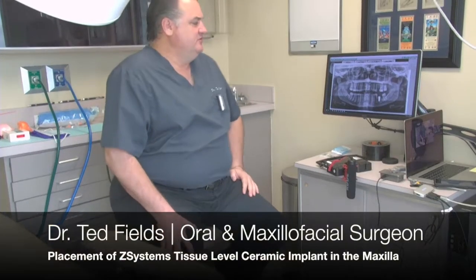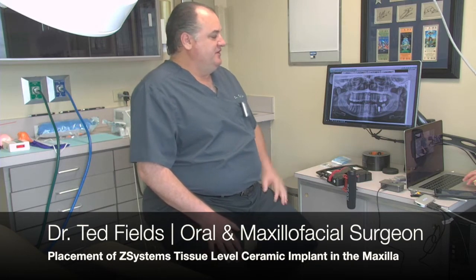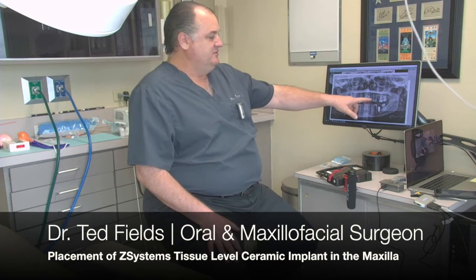Today we're doing a simple upper second premolar implant. We're using Z Systems Z5C implant, a two-piece all ceramic tissue level implant. So today our goal, can we see the film here? Yep.